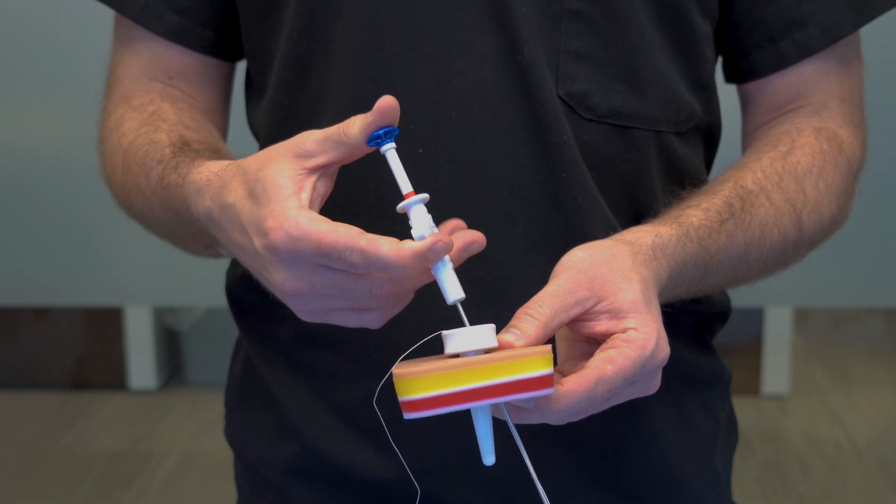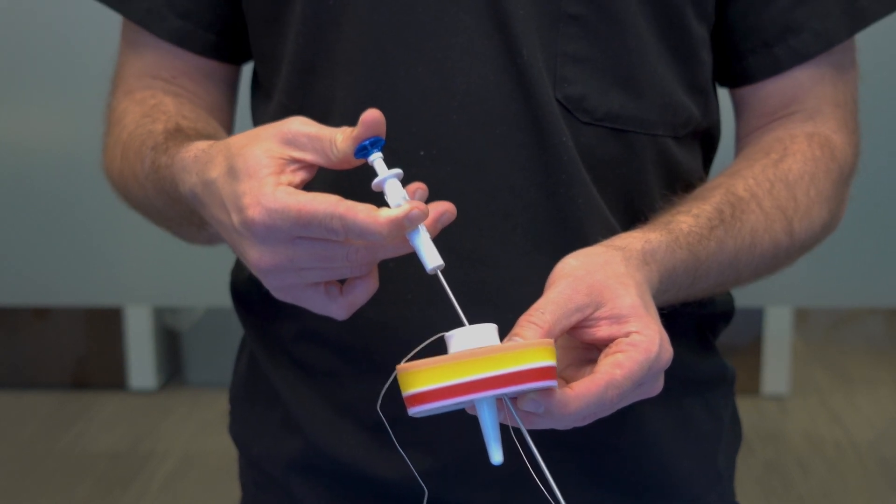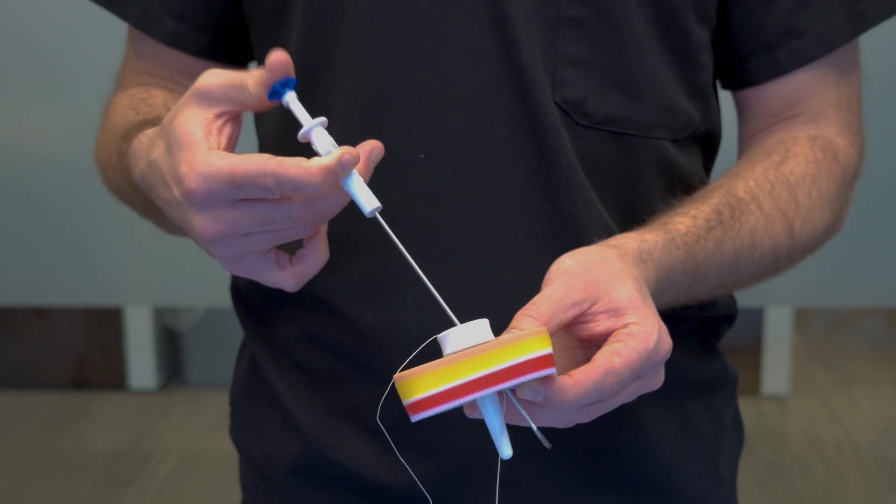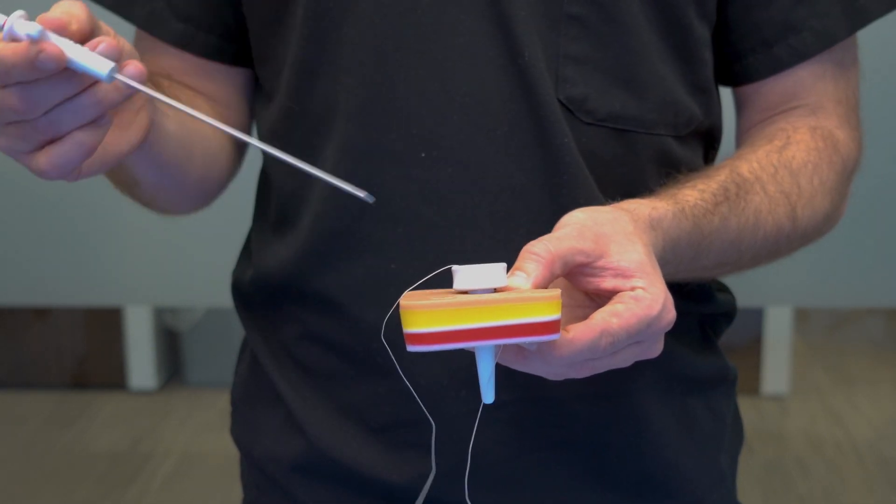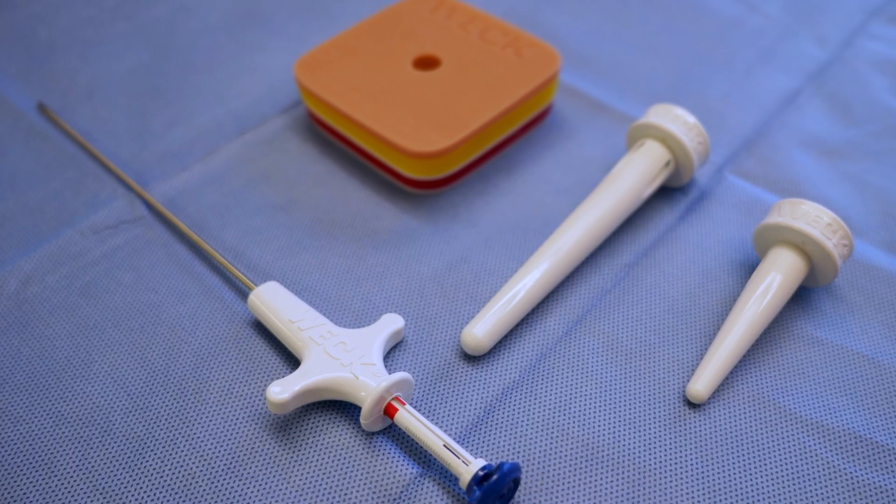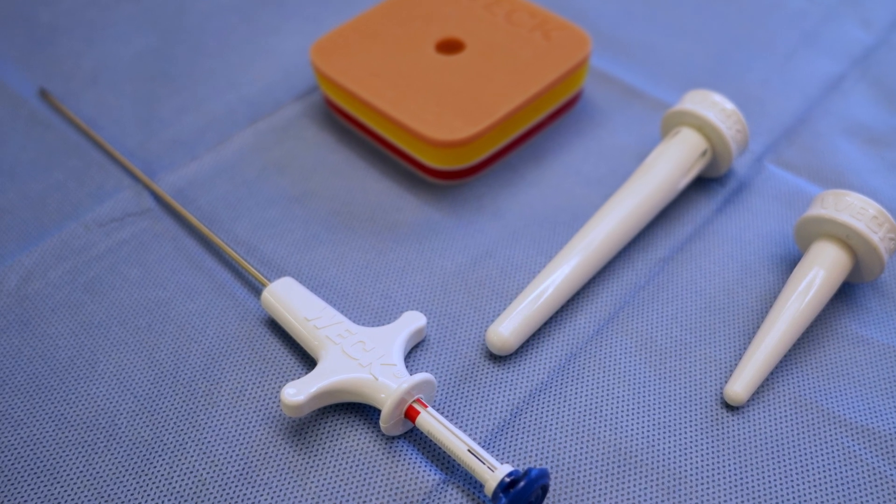Once the passer tip is through the soft tissue, press the button to release the suture from the suture passer. Release the button and remove the suture passer from the body. Ensure jaws are closed and the red band is showing.